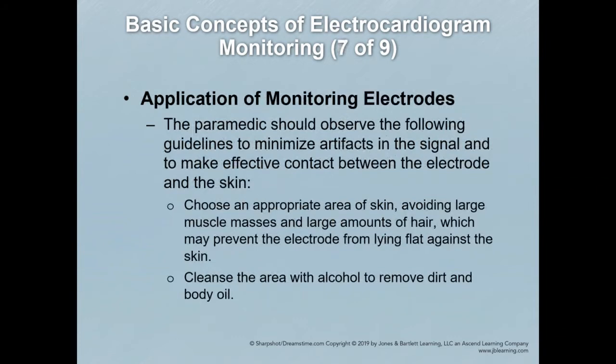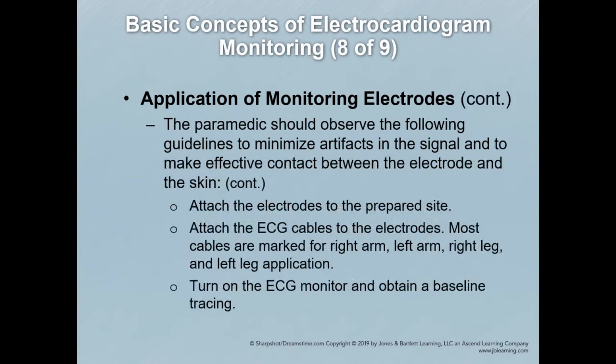So make sure that when you apply electrodes, you put them in the appropriate area. We know that they have an adhesive back on them. You'll get those as a practical exercise in running EKGs on each other. They have an adhesive back. Make sure that the contact with the skin is not overly hairy. It is clean, and you might have to use an alcohol prep to remove dirt or oil for someone in order to obtain a good tracing.